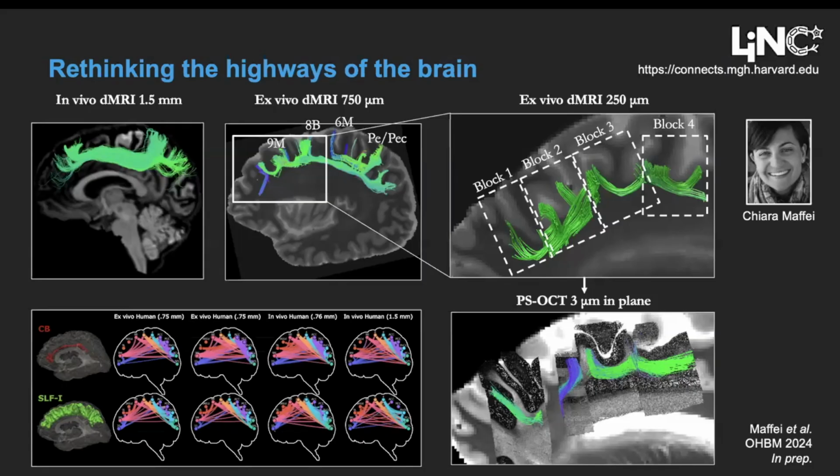So we think this is important because it reflects on a lot of the work that we do automating the reconstruction of these pathways. In tractography, we typically think of these pathways as just one thing that goes from point A to point B. But actually, each of these pathways is its own connectivity matrix. That also has implications for how we understand the function subserved by these pathways, and how we understand alterations at different points along the pathway that we see in disease.